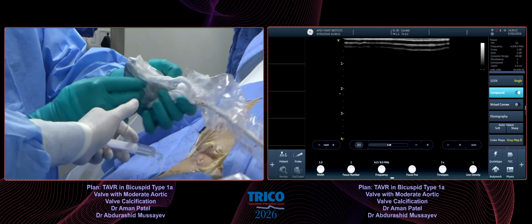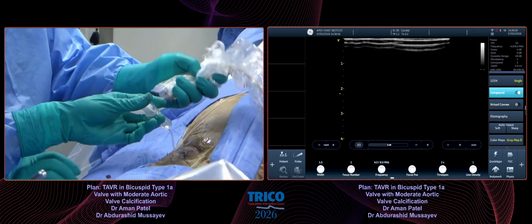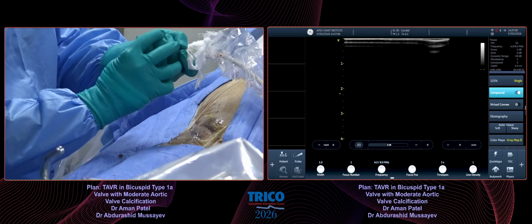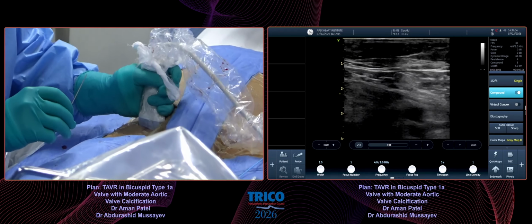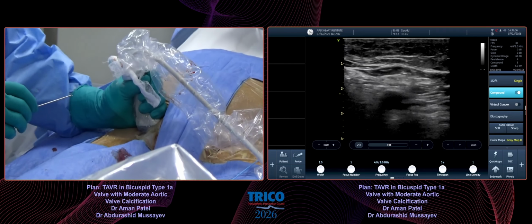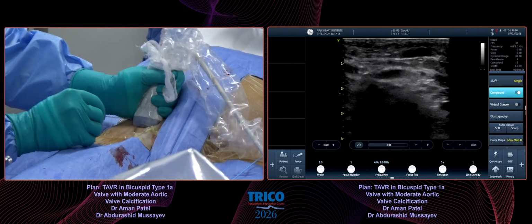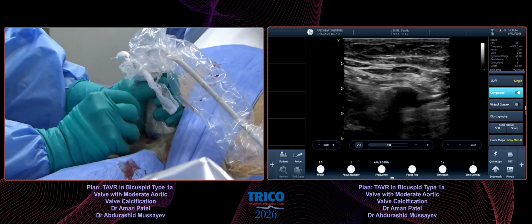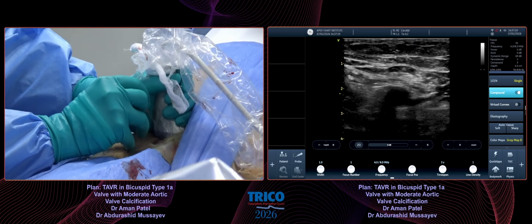Hello, Dr. Abdul, this is Dr. Anand Rao from the panel over here. Almost all the time we use micropuncture. My question to you is, a lot of interventional radiologists do a linear puncture versus a transverse puncture, which is what cardiologists do. So what is your preference? You do this transverse approach?